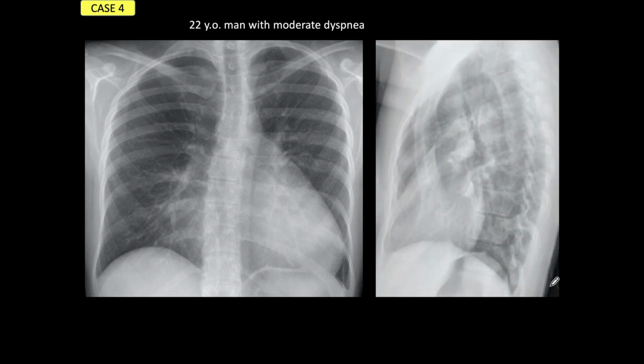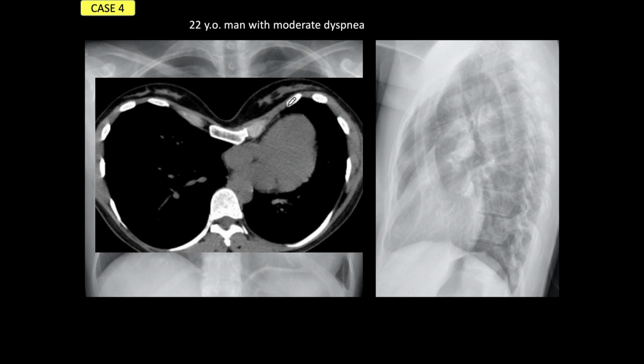And what you see in the lateral is a very obvious thing, a marked pectus excavatum, visible here in the axial CT. See how there is no room here for the heart, and the heart is displaced completely to the left side because it has no room there in the area between the sternum and this dorsal spine. So a possible diagnosis of pericarditis, myocarditis, or myocardial dilatation of the heart is easily put to rest because you see a marked pectus excavatum there.